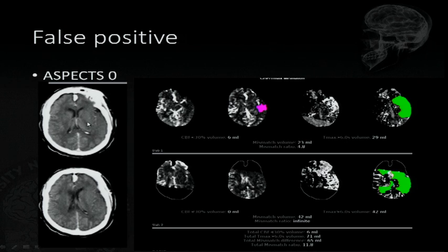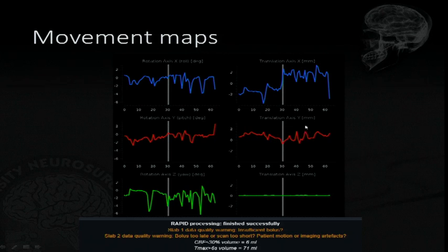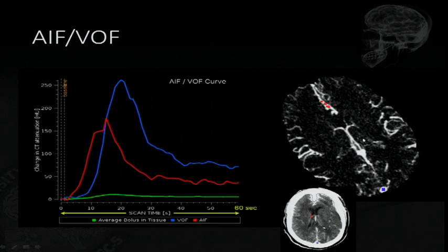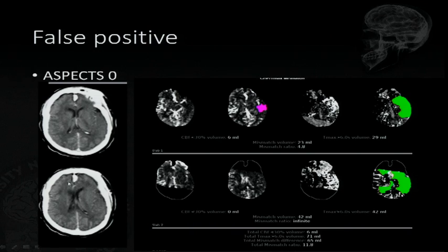So with this patient, always trust also your non-contrast CT. Okay, so this patient had complete sulcal effacement, hypodense MCA territory. We obtained this that showed this little core with this big penumbra, but this is that patient with a lot of motion. Okay. So we took that patient and reperfused, and the patient ended up having the same MCA stroke, okay?